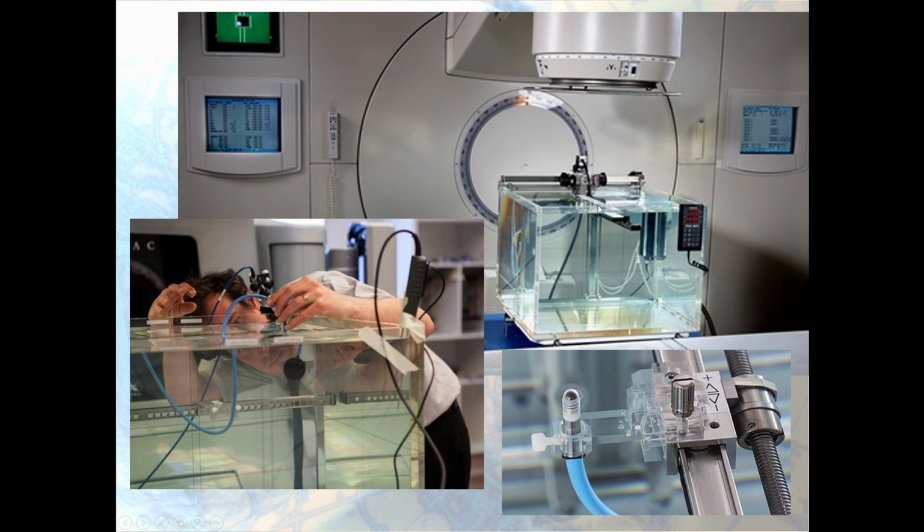This tray allows displacement in X, also Y, and it can also dive, in Z. Using a radiation beam and moving the chamber from place to place, it will take time, but you will be able to record the dose being delivered into each and every point in the water tank.